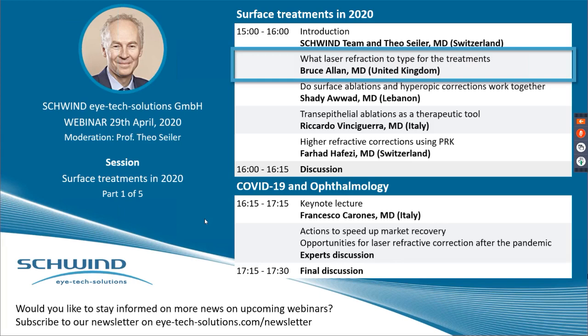When we're dealing with irregular astigmatism, and we are wanting to drive a treatment for that, again, if we get a good wavefront scan sequence with a large enough pupil diameter, that's 5.5 or above, we will use that to drive the treatment. If we don't, then we are looking at a corneal wavefront guided treatment. So we're always looking for a good scan sequence. And if we don't get a good scan sequence on the topography either, then we might do a simple PTK and then come back once the eye is healed and look again and see if we can get a scan sequence after that. But then we are phoning up Paolo Vinciguerra and asking him to do sequential liquid masking. I think that's what we're looking at that stage.